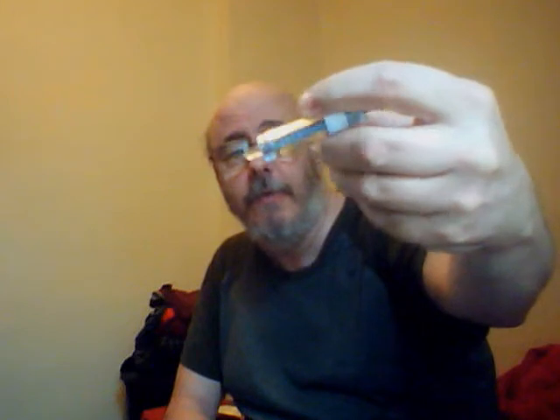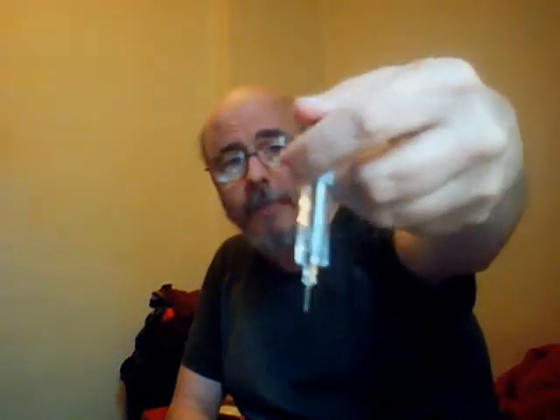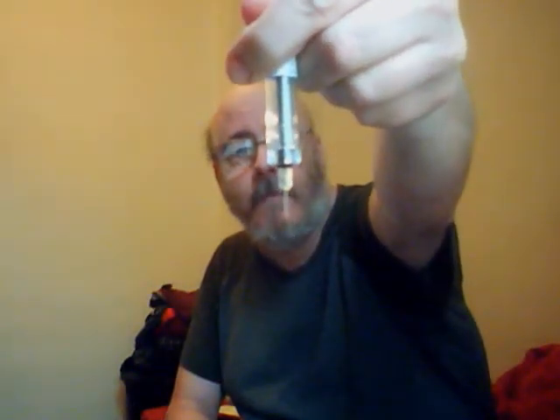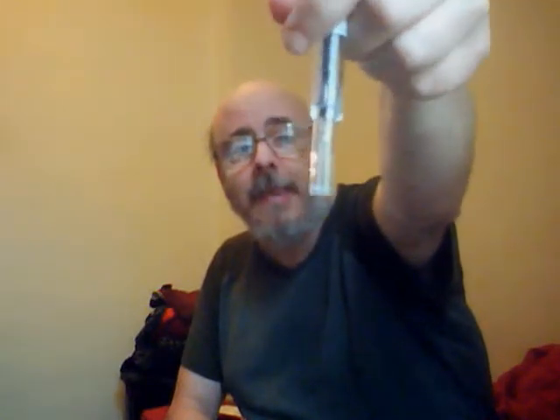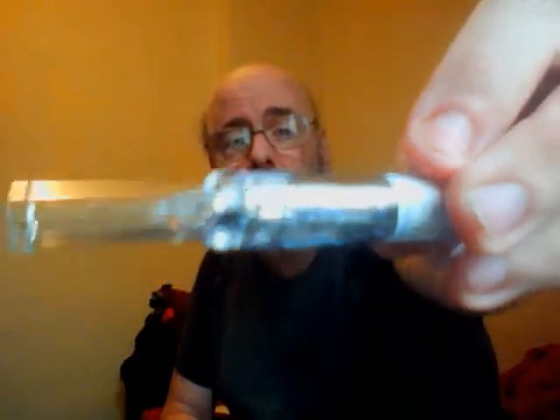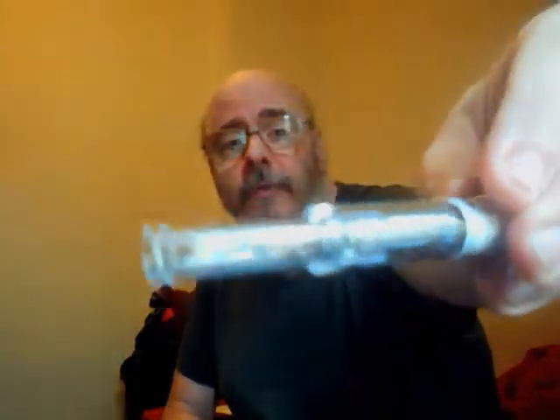Now, you can see that the medication has been dispensed. The plunger is completely down. What you now need to do, still keeping your finger on the plunger, is press. I've got a little drop of medication still there. You press on the plunger once more, real hard, and a cover will be ejected to protect the needle. And you can see, if you look here, there is a spring load in there that holds that cover, and you can see the cover down there. Then you just take this and you drop it in your sharps container.